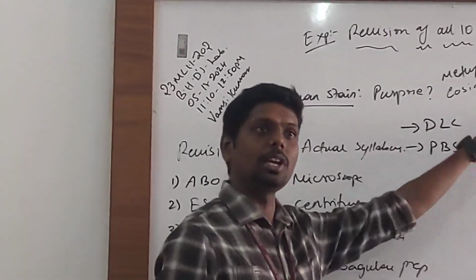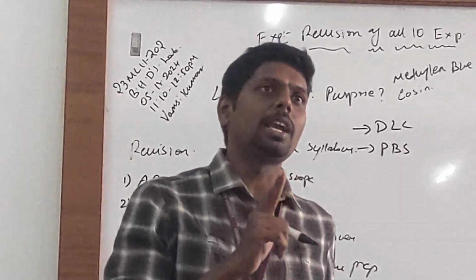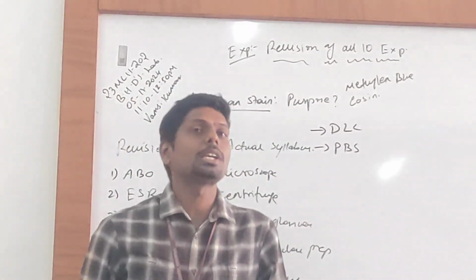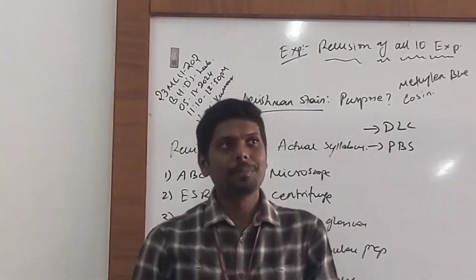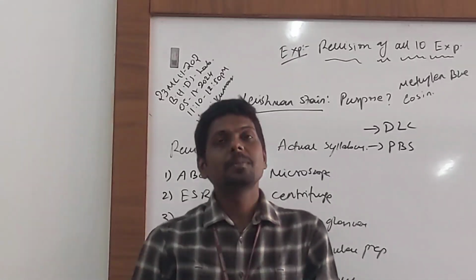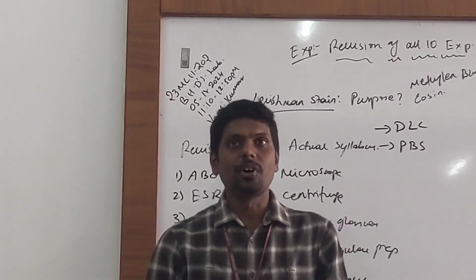For studying both granulocytes and agranulocytes. So all these hematological stains are called by another word. They fall under one classification. What is that? All these stains together are called by a single term. Yesterday I said it. It starts with R. Romanowsky stains.